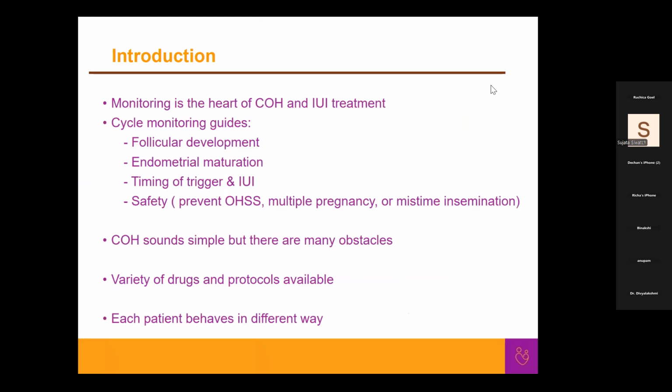Monitoring is the heart of COH and IUI treatment. Cycle monitoring guides us about follicular development, endometrial maturation, timing of trigger and IUI, and safety in terms of prevention of OHSS, multiple pregnancy, and mistimed insemination. COH sounds simple.